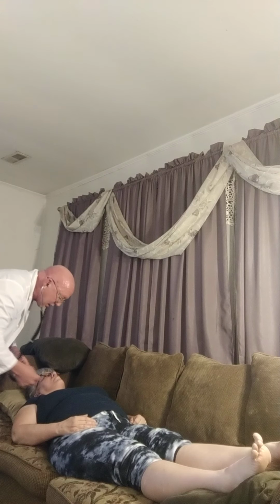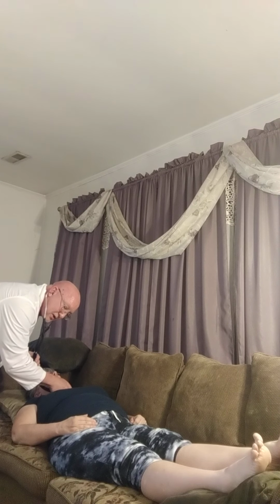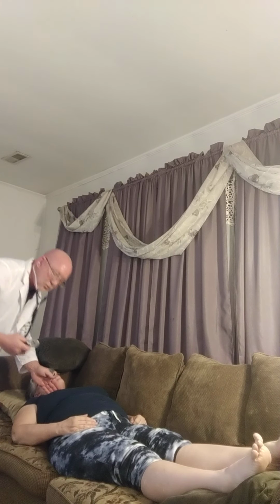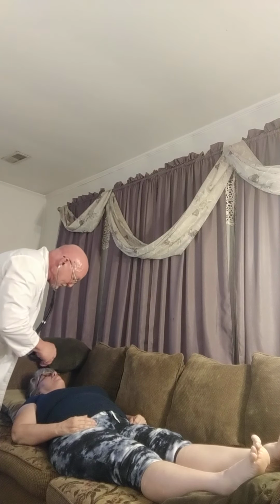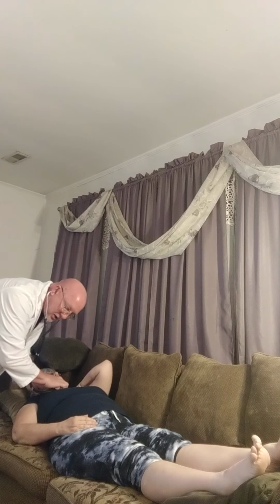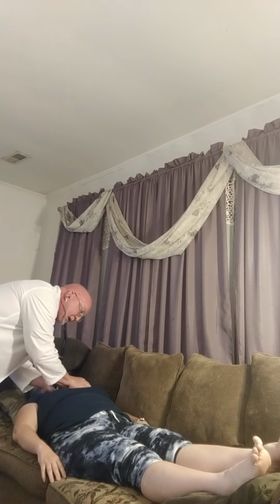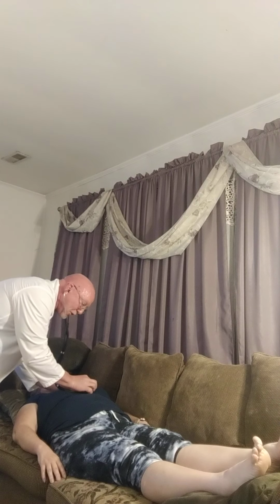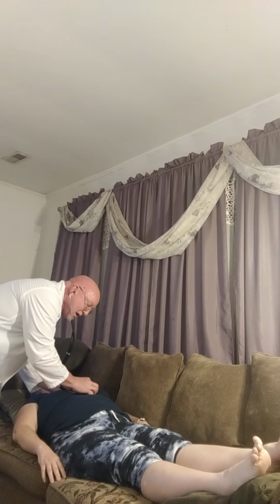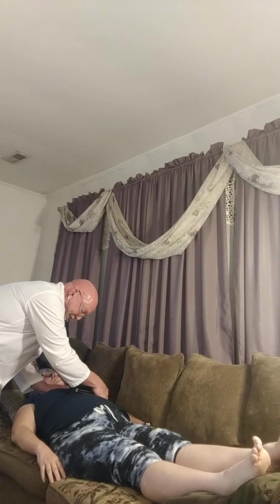Good. No bruits. When we palpated, we couldn't feel any thrills down through here. We didn't have any thrills. We're going to go to the second intercostal space on the right. Aortic. Slide over to pulmonic. Down 1 space to Erb's. I'm just using the diaphragm right now. Down 1 space to the tricuspid. Good. 5, the bicuspid, and then move out the midclavicular line.